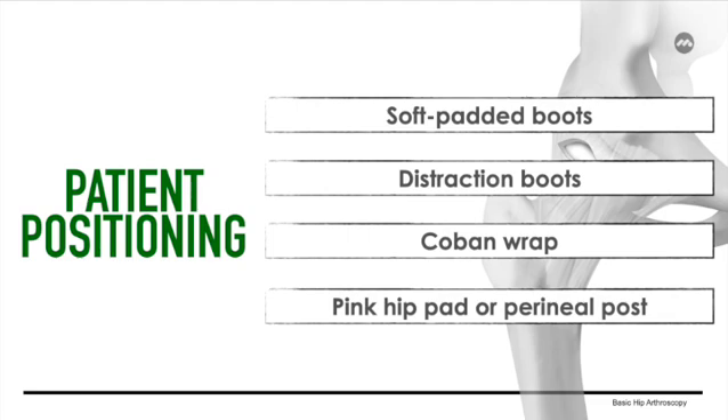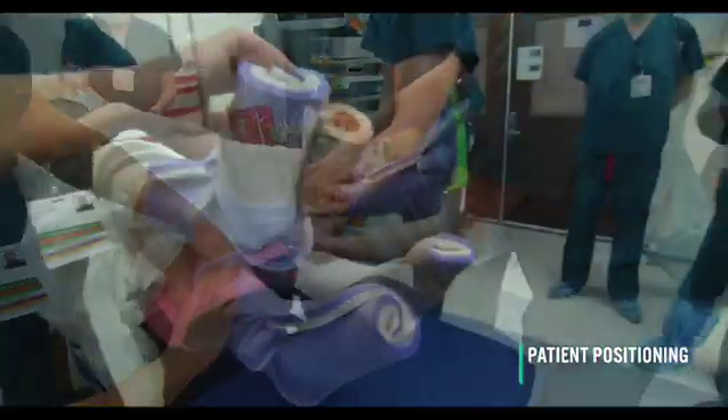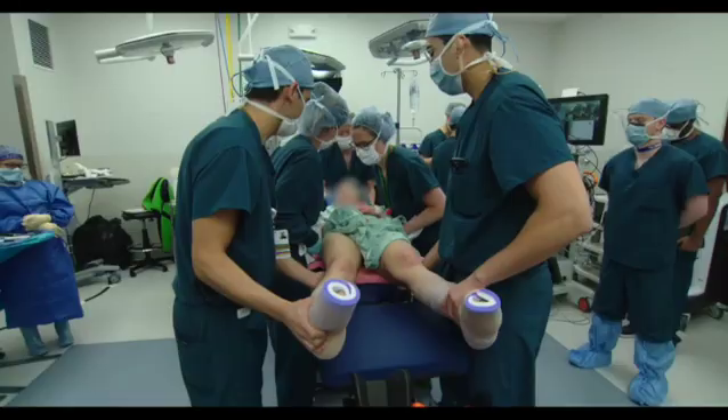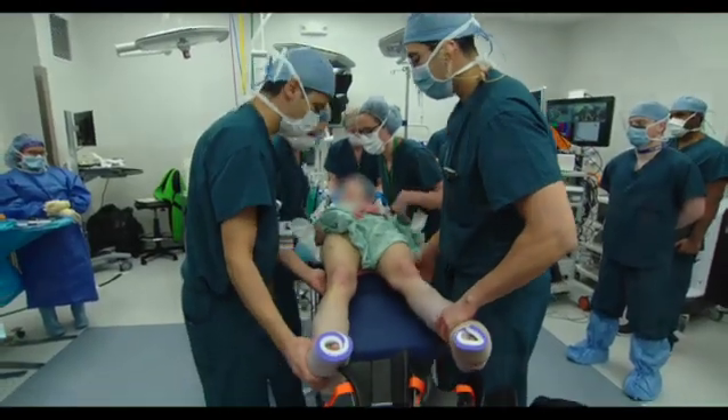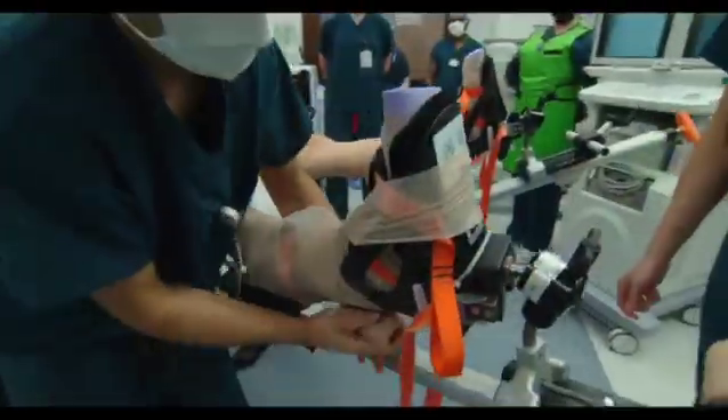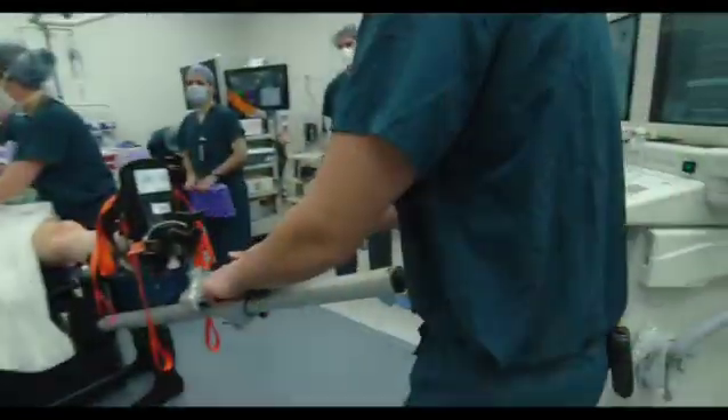The patient is positioned on top of a pink hip pad, which creates friction allowing for a postless hip scope. The soft padded boots are tightly wrapped around with a coban wrap before being set in place in the surgical distraction boots. An additional coban tape layer is wrapped around the surgical limb, which had been previously secured into the corresponding traction boot.